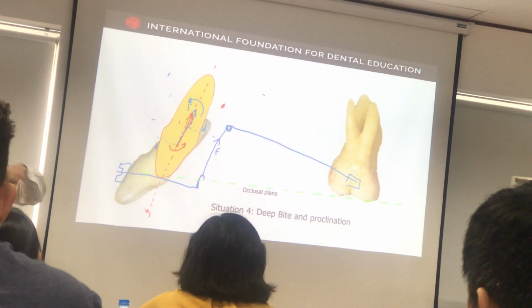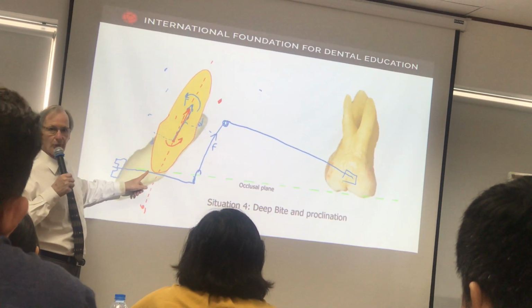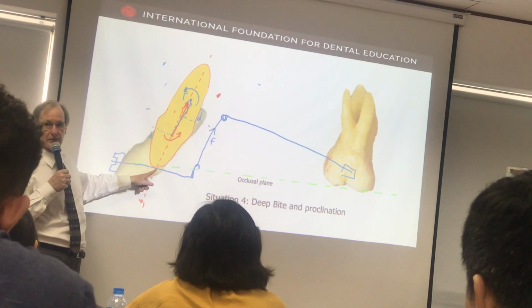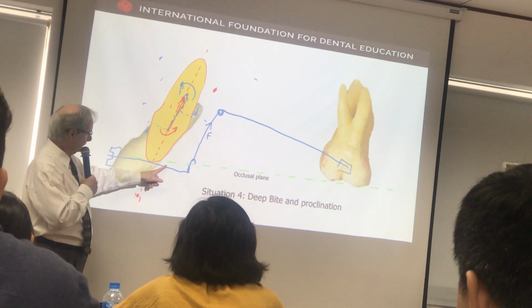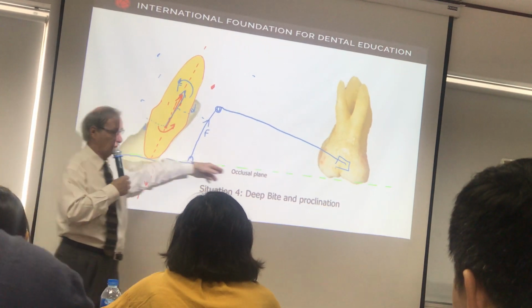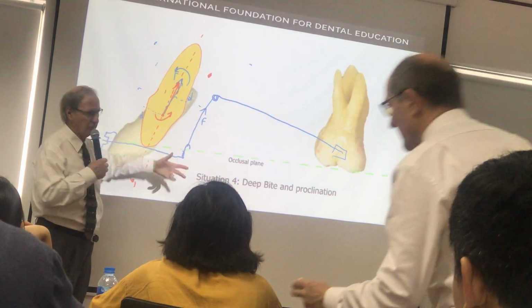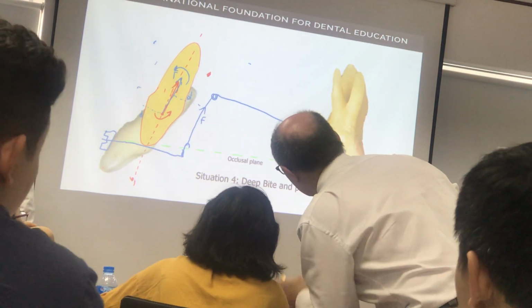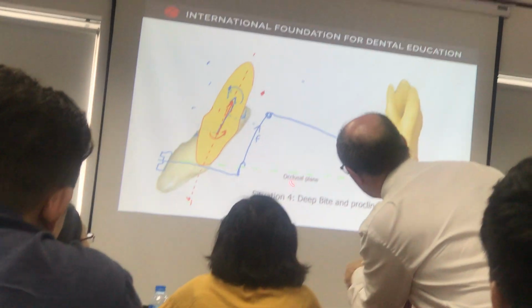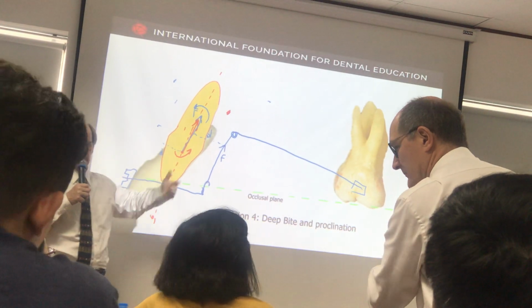So your question was good. You can reduce the D, but then you stay on this side, the moment is never the right side. You can reduce it almost to here, then you have pure translation. As soon as you go to the other side, you start rotating the other way. And then you can push it to stupidity, because then it becomes crazy. But usually this is very simple to do. No, it looks like a straight wire, because when it's tied in, it looks like a straight wire system.